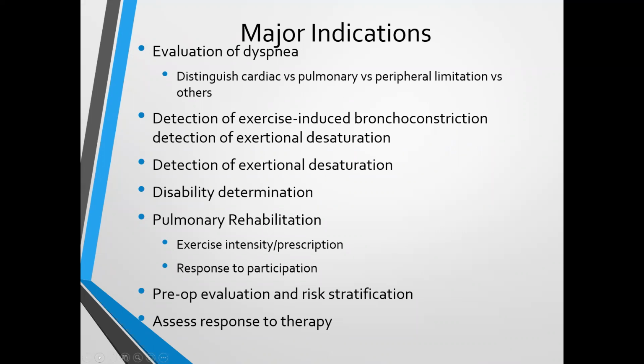The other thing regarding surgery, it may identify individuals who maybe are not good candidates. They're too sick, their limitation to any sort of exercise, load or stress is too limited, and the likelihood is they really would not do well. They're just too sick. And also to assess response to therapy. And I alluded to rehabilitation, maybe that, but there are obviously many other forms of therapy, to try to get an idea, did we get any benefit from this that's actually measurable and demonstrable?